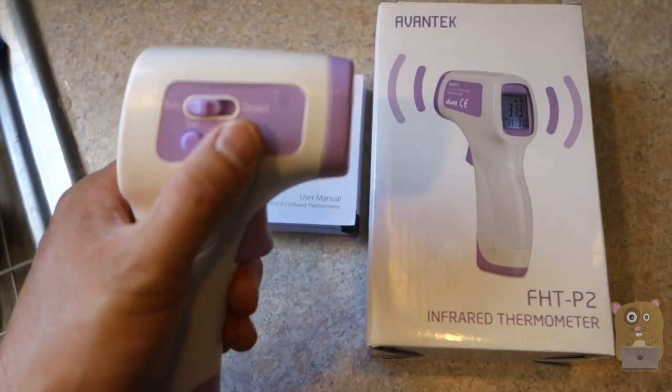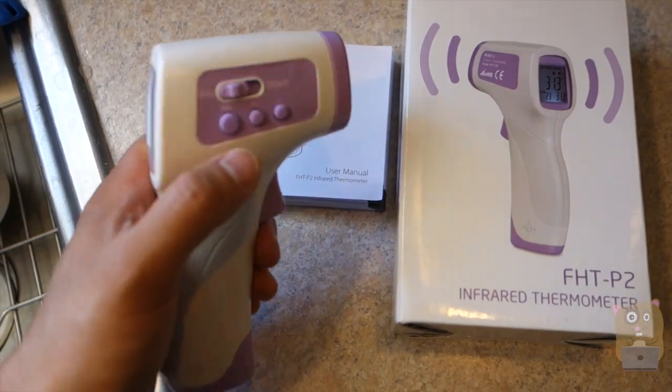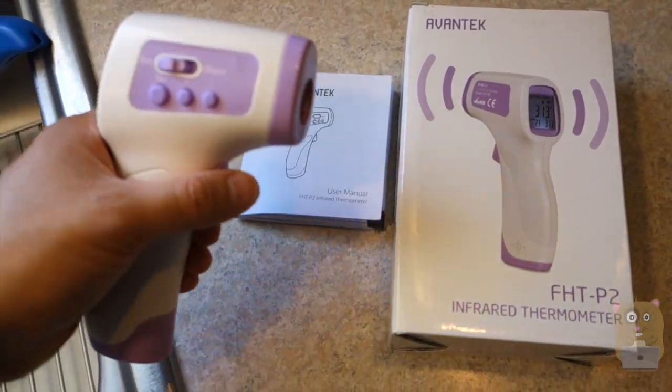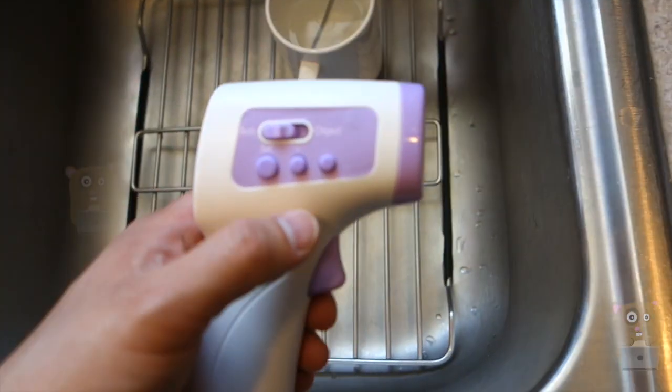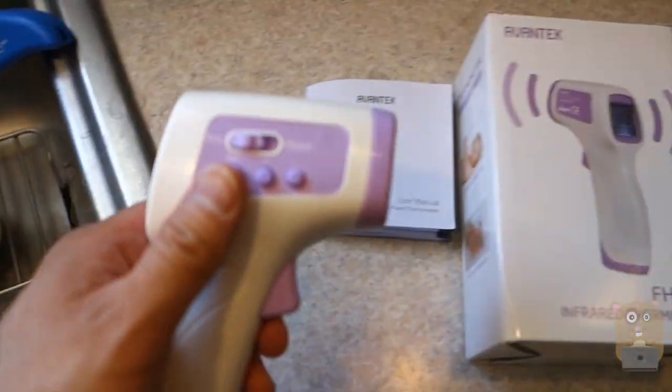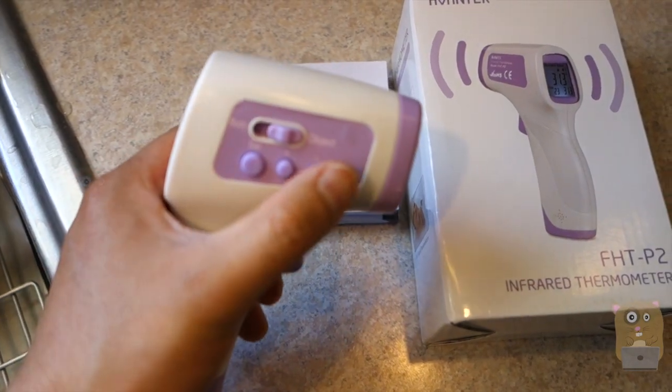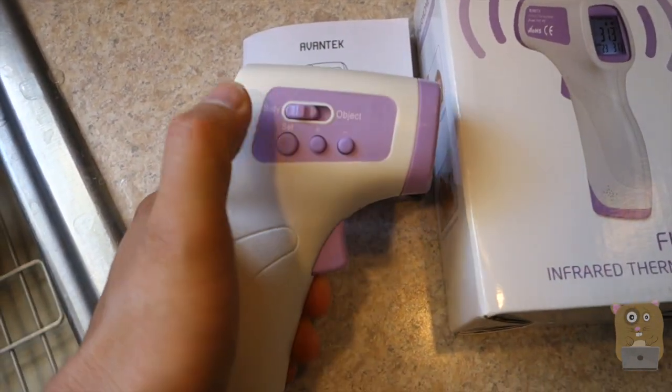This one can measure temperature for objects as well as body temperature. So it's a non-contact way of measuring temperature, rather than using a mouth thermometer or an ear thermometer, by just switching it between object and body mode.